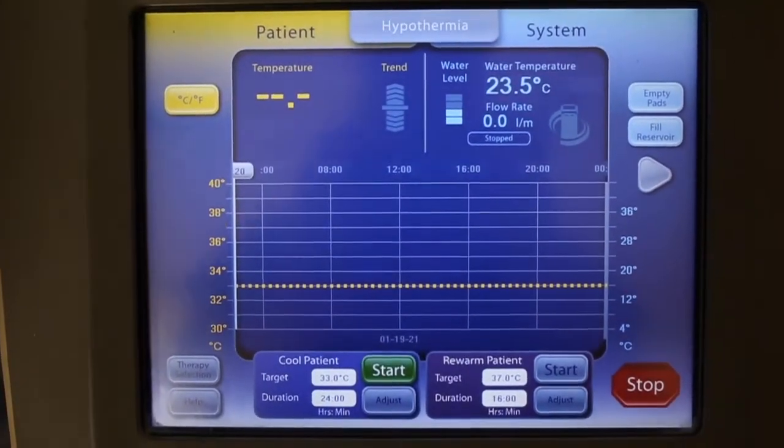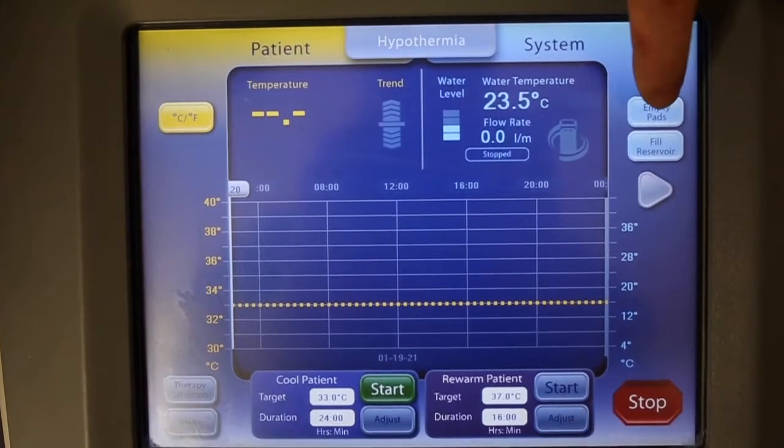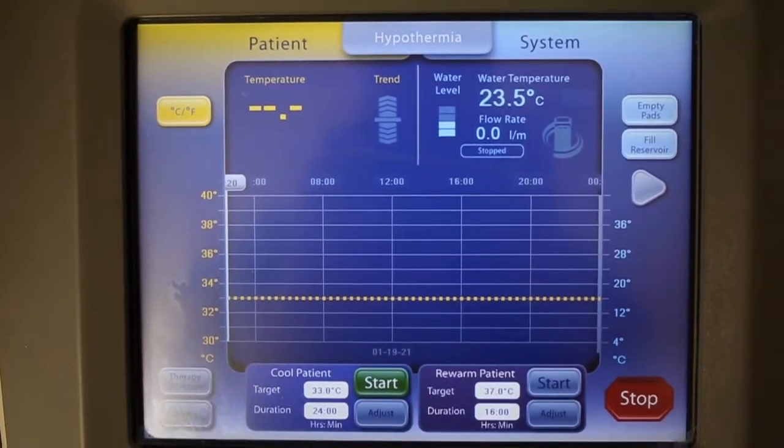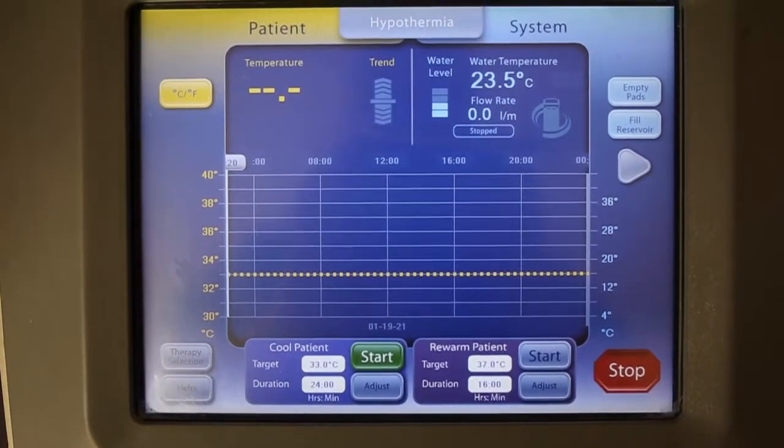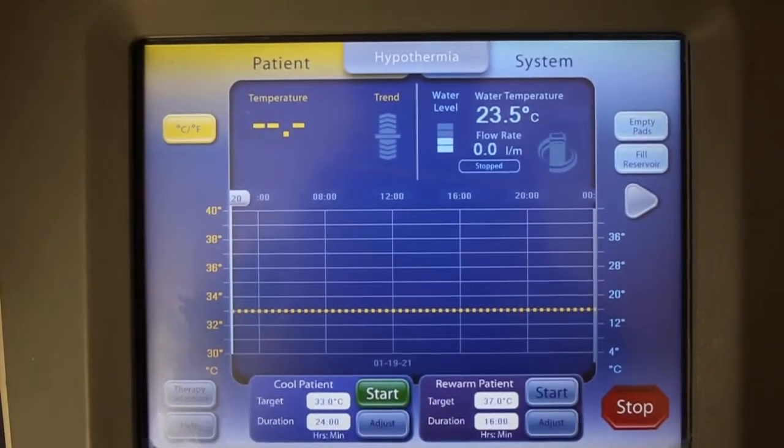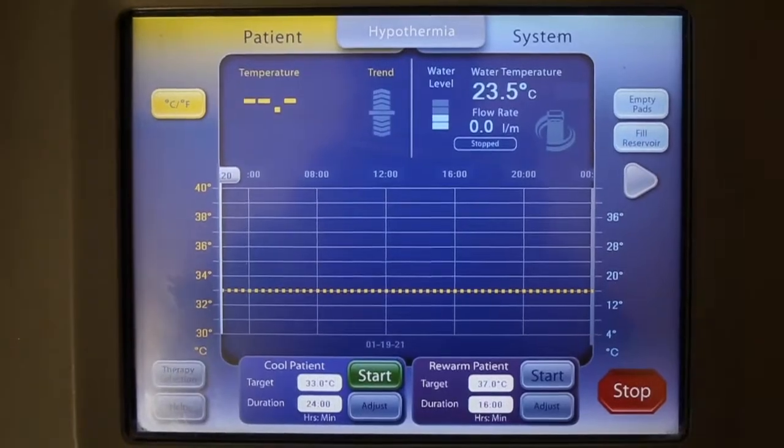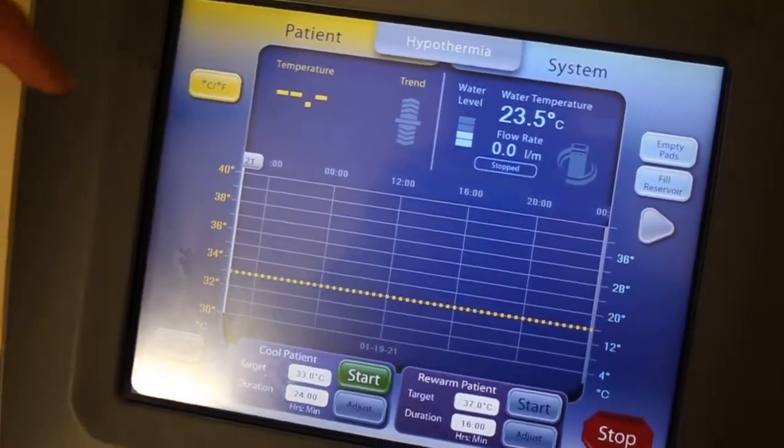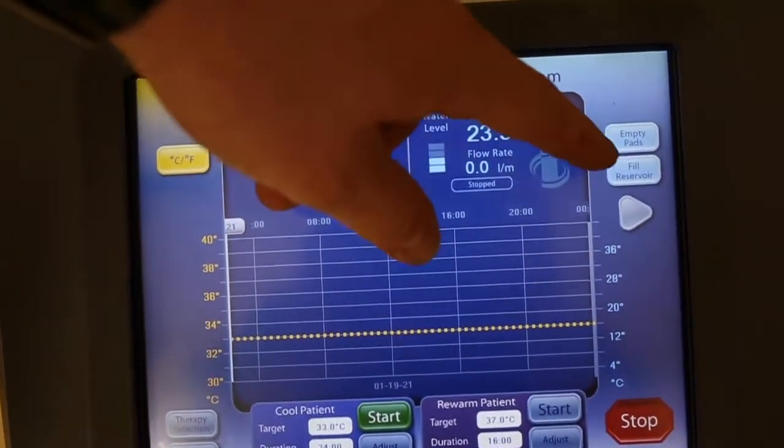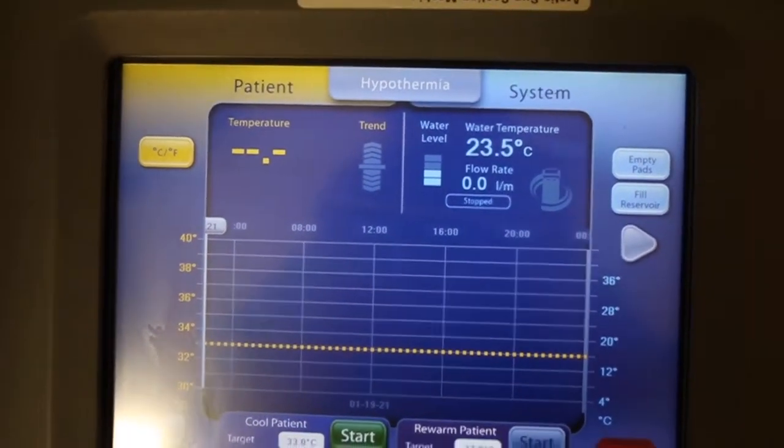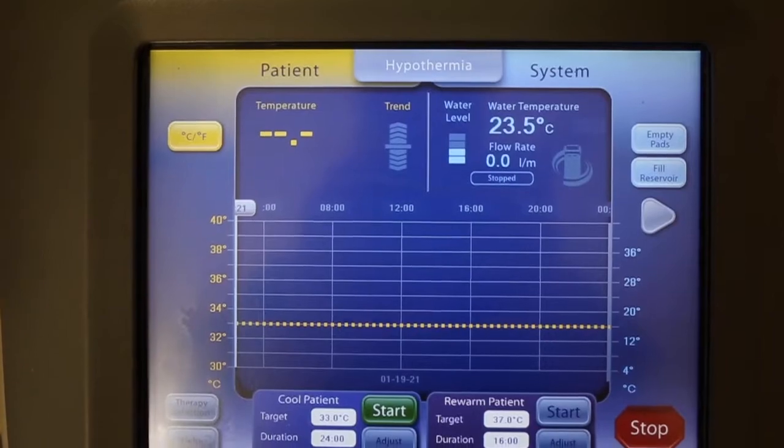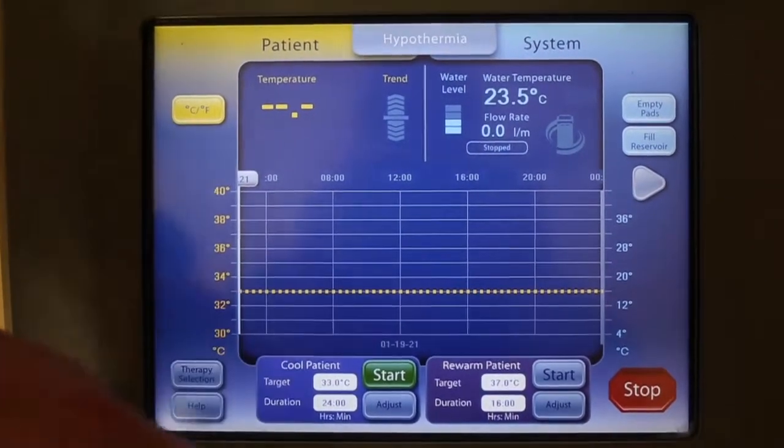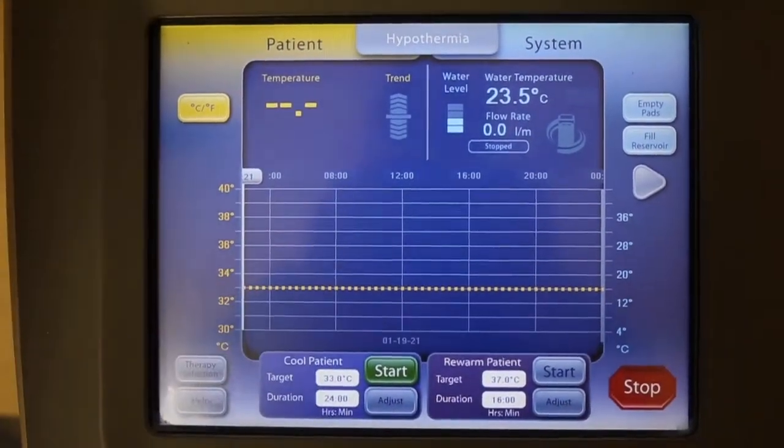When you're done with treatment, empty the pads here. If you need to do a procedure, like if they're going to MRI or CT, you can stop it. Filling the reservoir if empty is something CSR would do - we wouldn't deal with that. To stop the treatment, the stop button is here. That's about it.